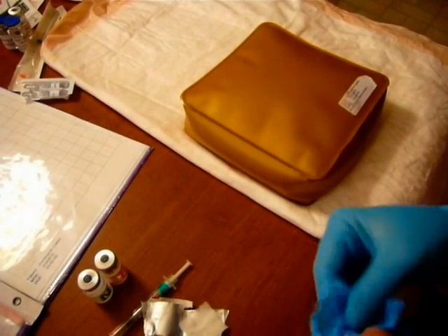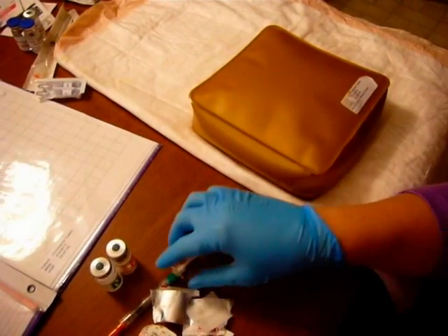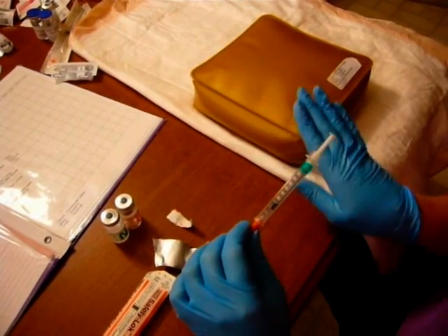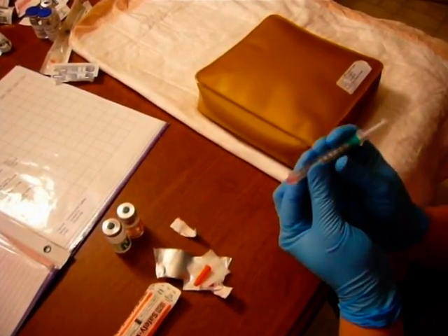Something that's different between a subcutaneous injection and the intradermal injection that you may have watched before is that with a subcutaneous injection, the beveled orientation does not matter. We're going to use a darting motion. Once this is dry, you're going to take the needle cover off and hold the syringe like a dart.